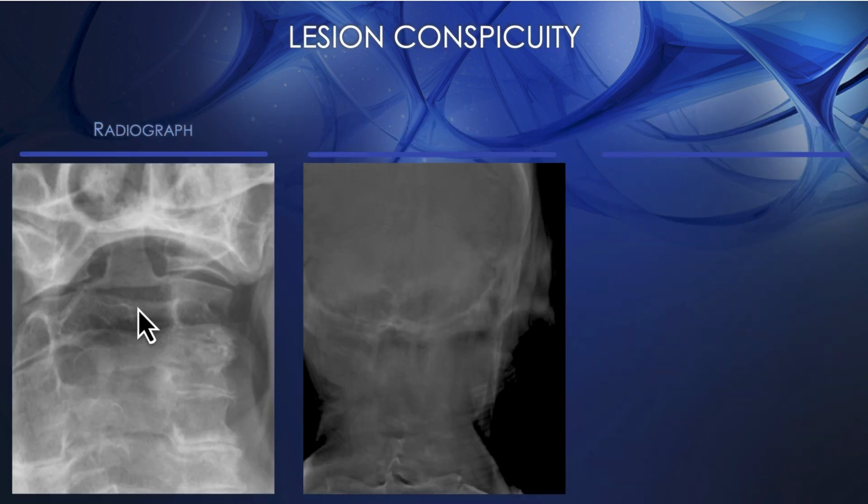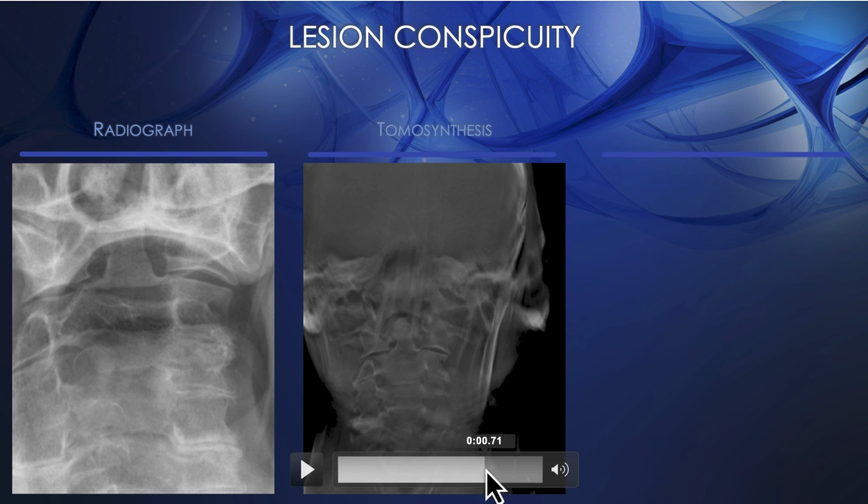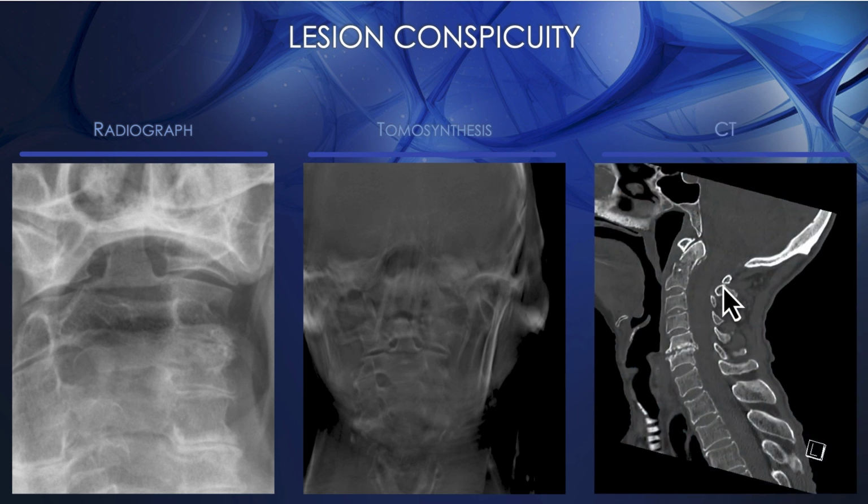Okay, so we have the radiograph here on the left. Here is a tomosynthesis series performed in the same plane. And right away you can see that the removal of structural noise enables you to more clearly see what is happening at specific planes. And as you choose a plane that goes through the mid-vertebral body, you can see there's a fracture at the base of the dens. Let me show you this on a CT exam, and you can see here's that fracture going through the base of the dens. There's no fracture superior to that, and that lucency that we did see doesn't really correspond to any pathology. It was probably caused by soft tissue. This advantage that you get with tomosynthesis is not unique to this specific study. Let me show you another case.